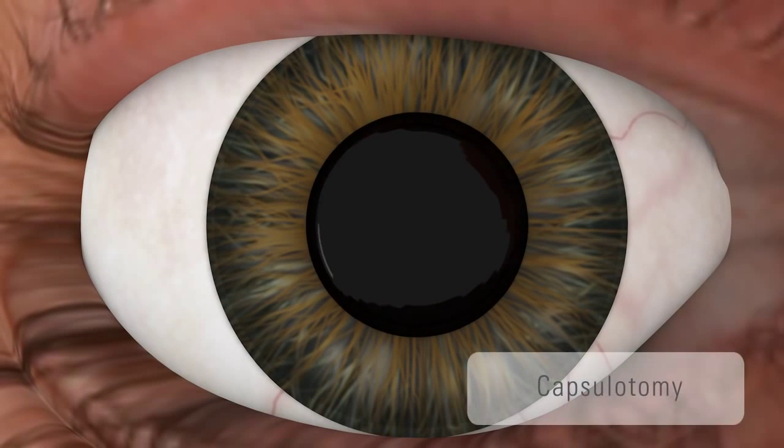In most cases, a perfect free-floating capsulotomy can be achieved without any tissue bridge thanks to the overlapping spots of the laser beam.